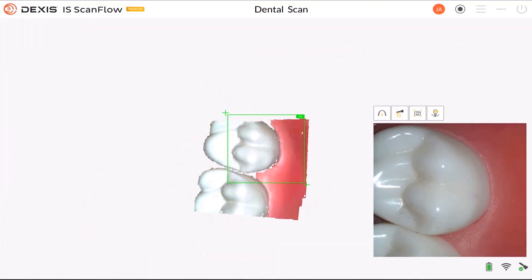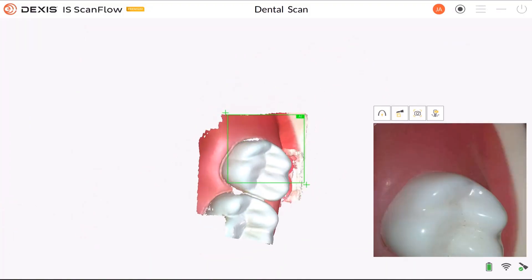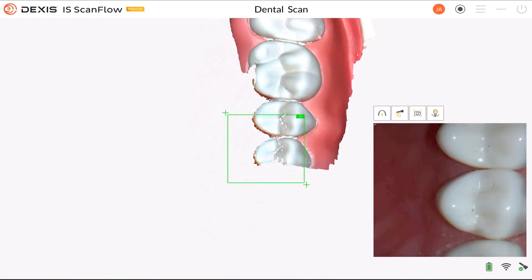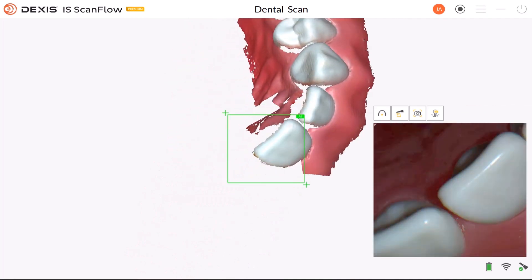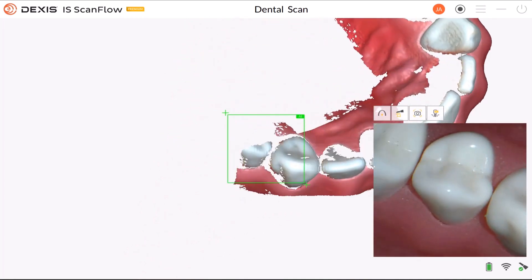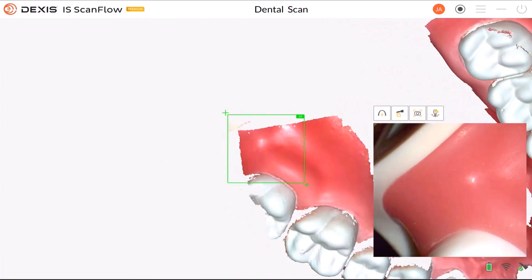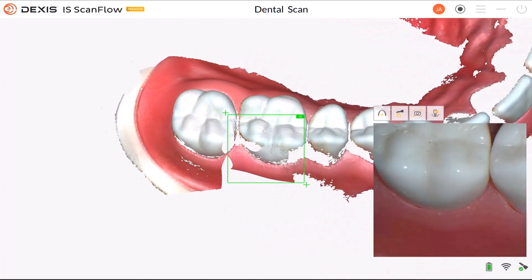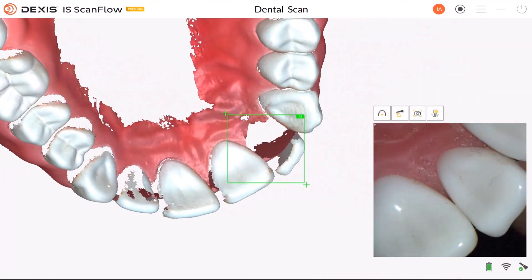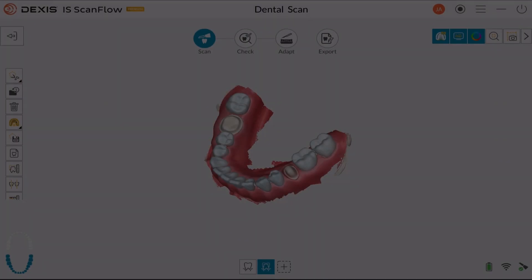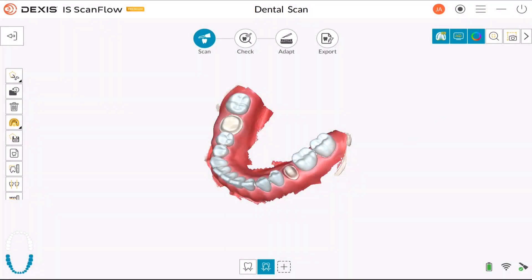The Preparation Scan workflow steps are to first take a new scan, next prepare the area for restoration, then take another scan of the preparation area. Use the Preparation Scan workflow in cases where the final restoration matches the existing tooth. The check step enables you to further process the 3D image to obtain the highest accuracy.